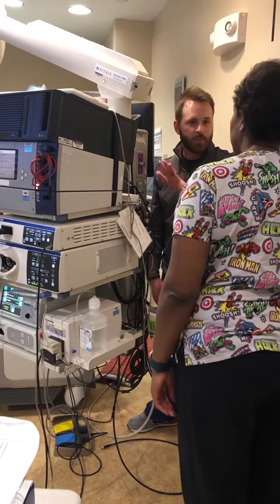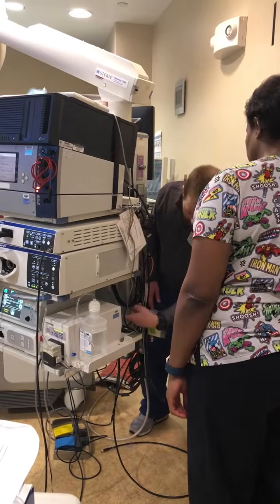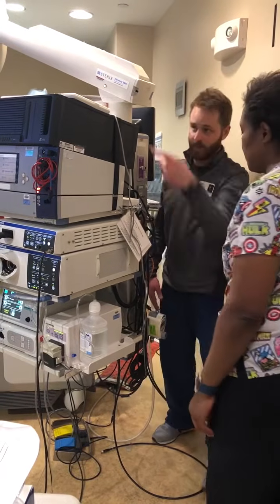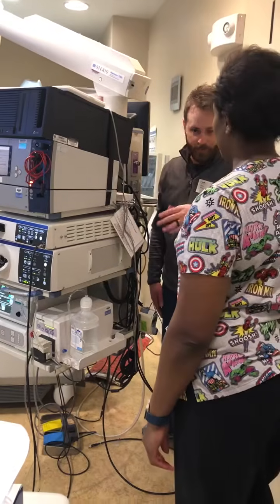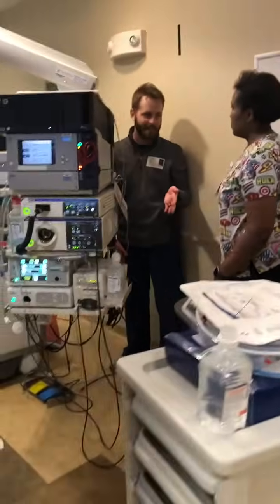If you do what we just said, turn on Spy, pick an input, and you don't have a picture, I would look behind the console just to make sure that's plugged in. Because if that's plugged in, this works 100% of the time. Okay. We've tried other, simpler ways to do it. It doesn't end up being simpler.